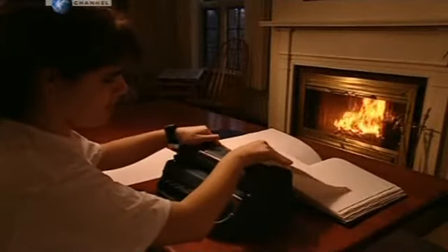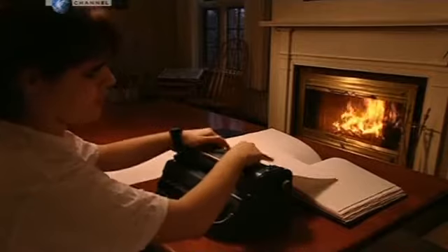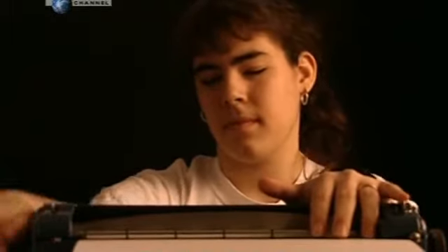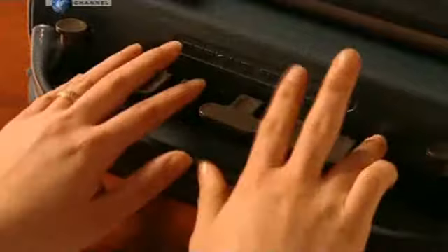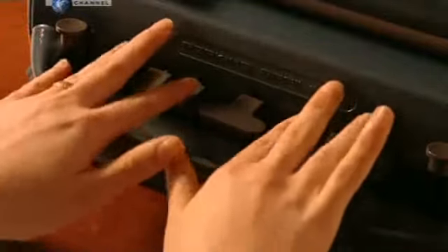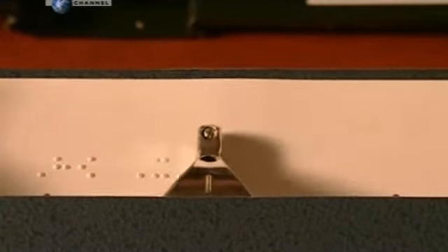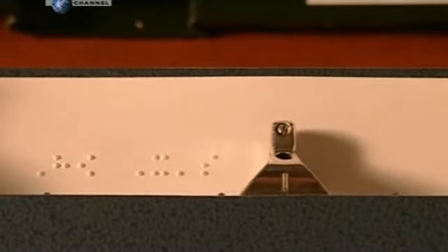Typing on a Braille writer is an embossing process, so you have to use thick paper. Single keys and combinations of keys are pressed to produce different configurations of dots, each signifying different letters of the alphabet. Communication at your fingertips.